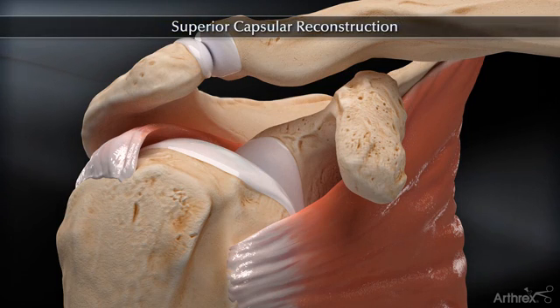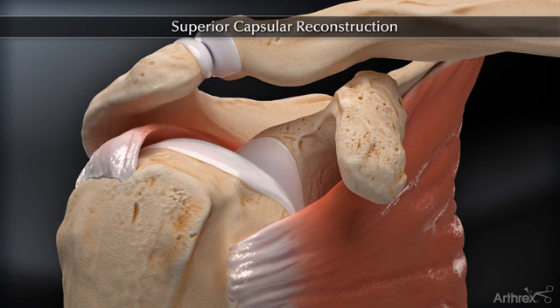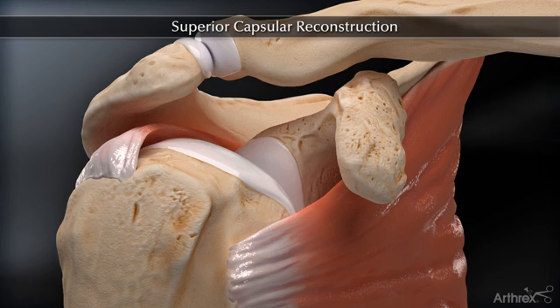The superior capsule reconstruction is a technique to address the massive irreparable rotator cuff tear. The ArthroFlex dermal allograft in this technique will span the superior glenoid and humeral tuberosity to help reduce superior translation and improve glenohumeral joint kinematics.